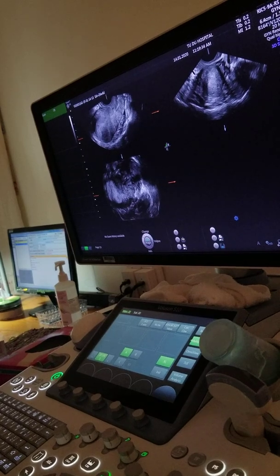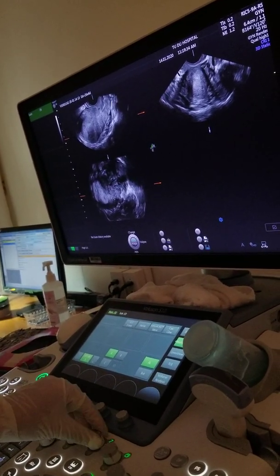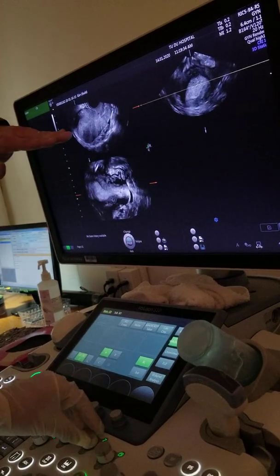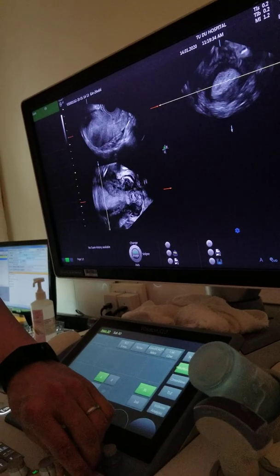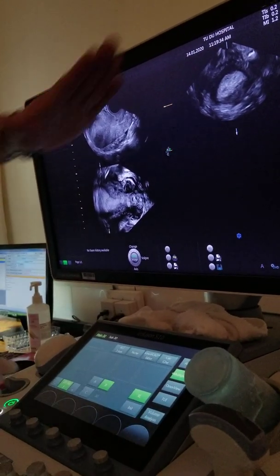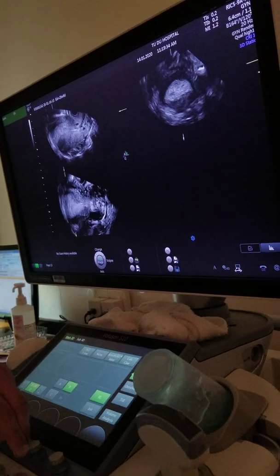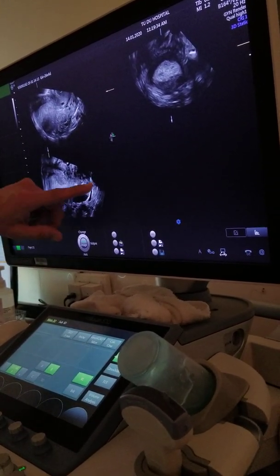Okay. All right. So now multiplanar A. You put this to the fundus. And you make it flat, flat, flat, flat. This is called the Z technique. I published this like 15 years ago. You make it flat. Okay. B. You see how B is now like this? So we make it flat. Z, Z, Z, Z. Here you go. Looking beautiful. See how easy? Make it flat right here. And this is the mid coronal plane.